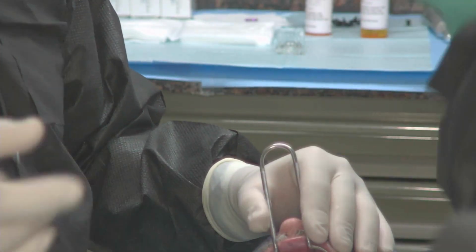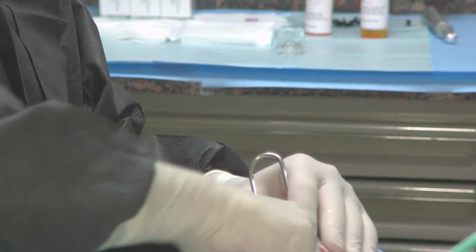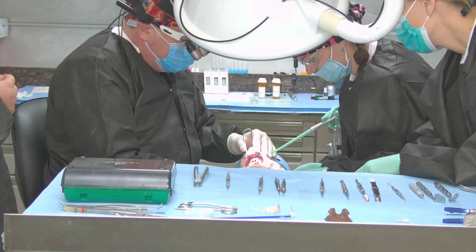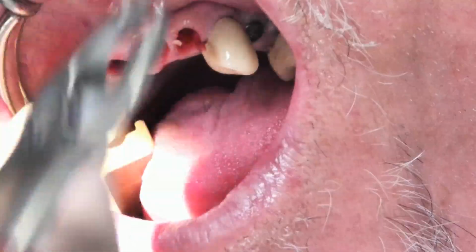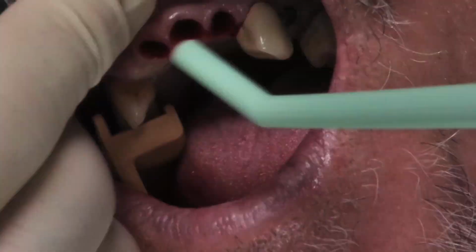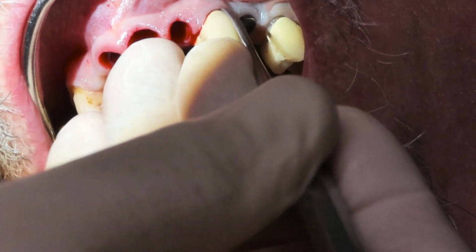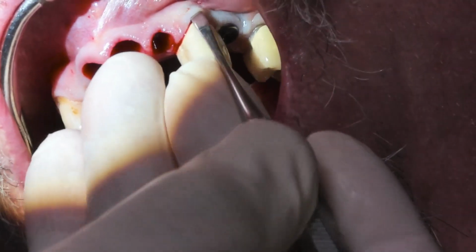So first thing we'll do now, forceps. We'll get started with the procedure. One of the things that we have to do is ensure that we try to preserve as much tissue as we can from extractions. Suctioning now. Okay. Take this from me. Because we're never going to have the tissue contour. Let me have my small elevator. So we're never going to have the tissue contours that we have now as good, again, as they're going to be here.